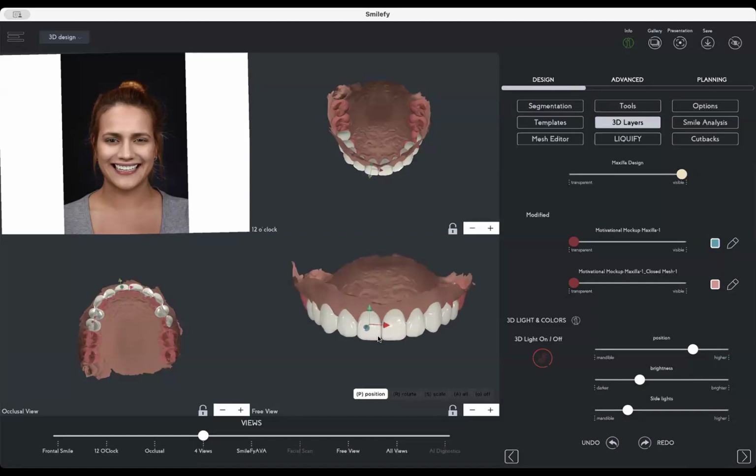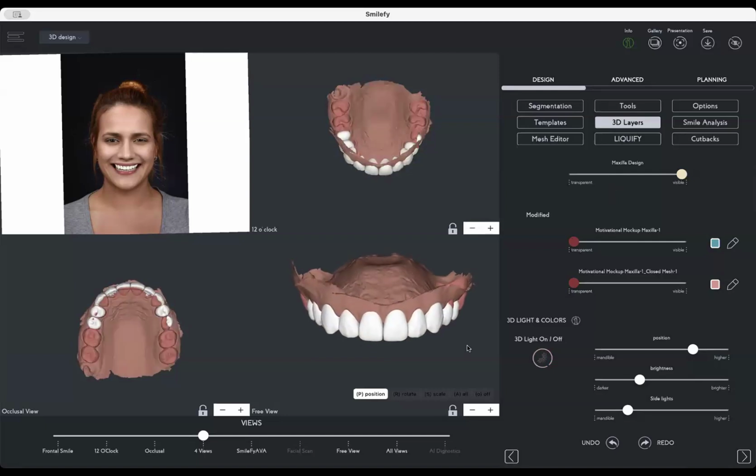Of course, everything we do is always improving the automation. So it's going to be more automation, more automation, more automation, and it's going to be easier for you. But that's a very, very long process, because we integrate 40 years of expertise in the area of smile design, and now we can talk about all this stuff in this more advanced piece of our design.